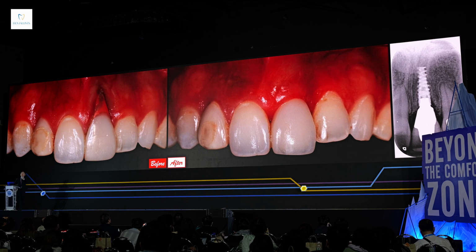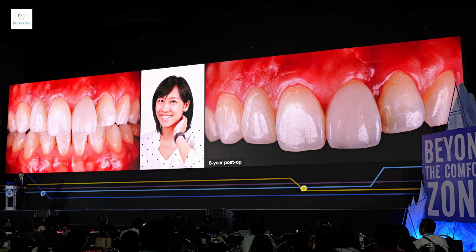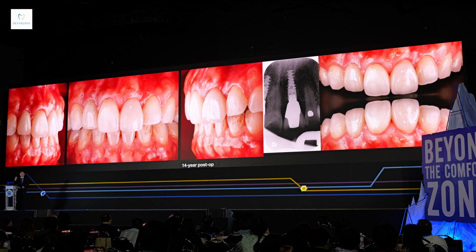And probably you or I will question how this could last. Could it be long-term or just short-term? Let me show you. At 8 years, the patient came back. On the left of the screen, it's still the same implant I placed, with no recession and no further bone loss, very healthy. What about longer? When the patient came back at 14 years, still the same. So that means we did grow bone, we did grow soft tissue, we did augment the bone well. And the key is that we take advantage of the healing potential.